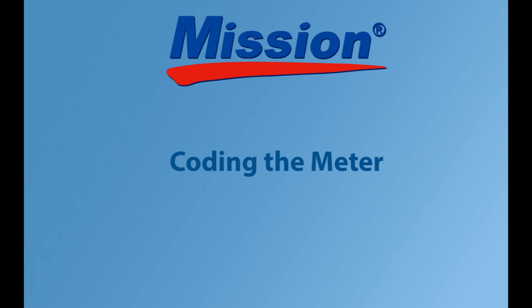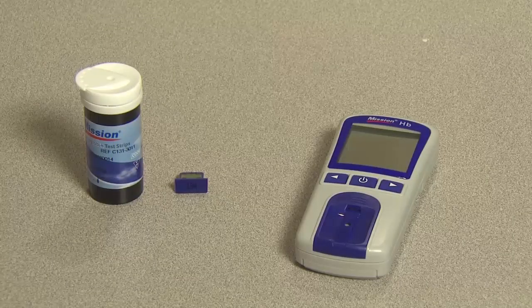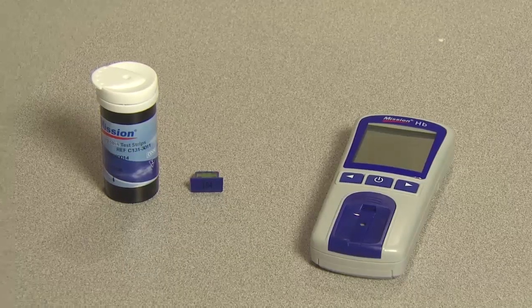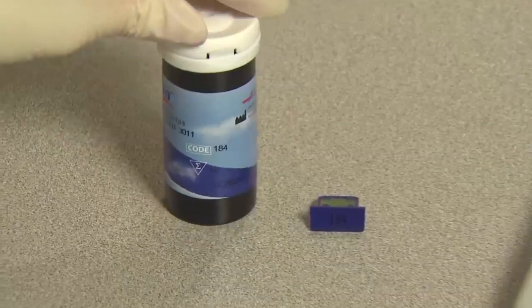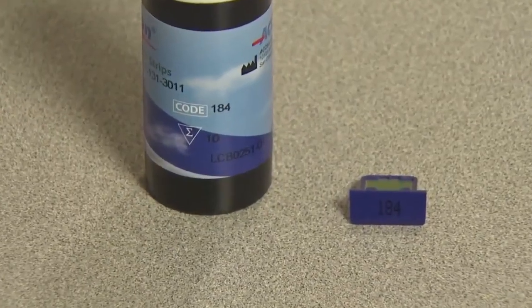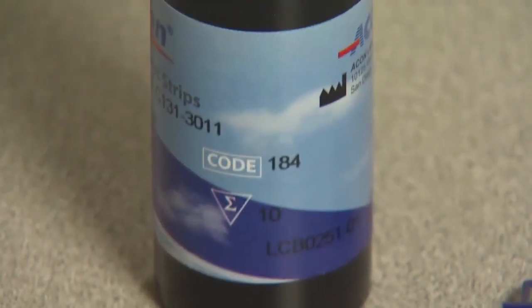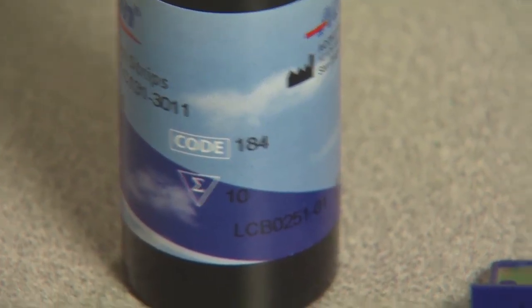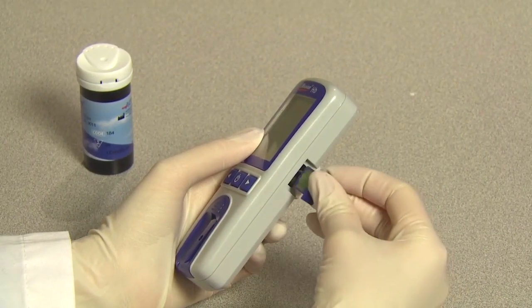Coding the meter. Each time a new box of test strips is used, the new code chip included in the box must be inserted into the meter. Compare the code number on the code chip from the box with the code number printed on the test strips canister. It is important to do so because results may be inaccurate if the two numbers are not identical. Insert the correct code chip into the code chip slot of the meter.